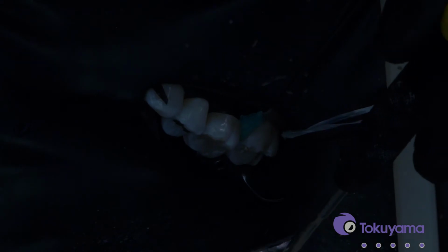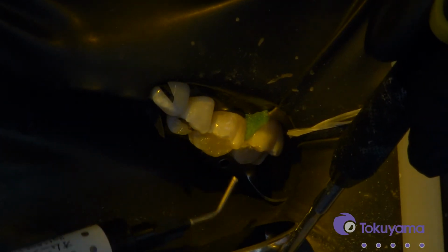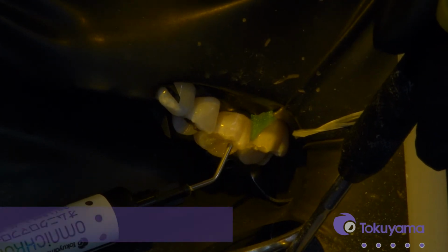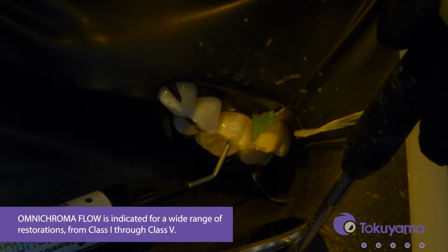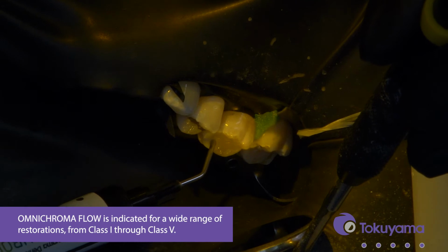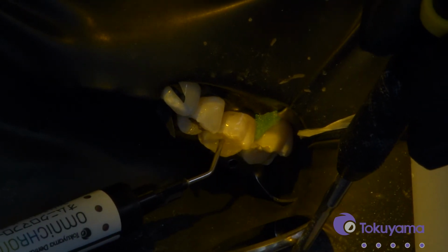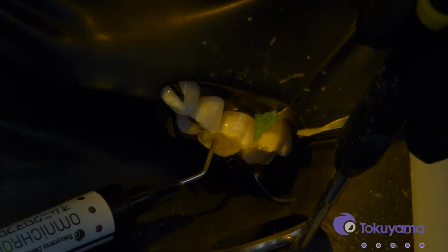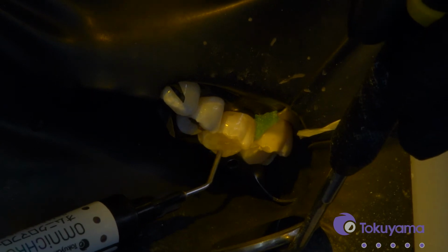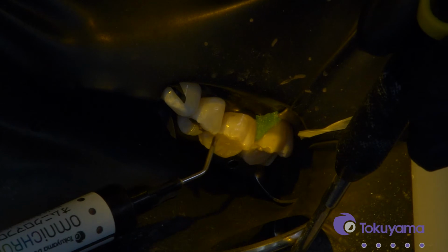Can I have a little bit more Omnichroma Flow, please? Thank you. So the name of this material is also a little bit deceiving. You hear flow and you think flowable, meaning I can only use this as a liner or underneath my restoration. This restorative material is indicated for all restorations as a definitive restoration. So you can use this for class ones, class twos, class threes, class fours, even class fives. It's a great material for any direct indication.